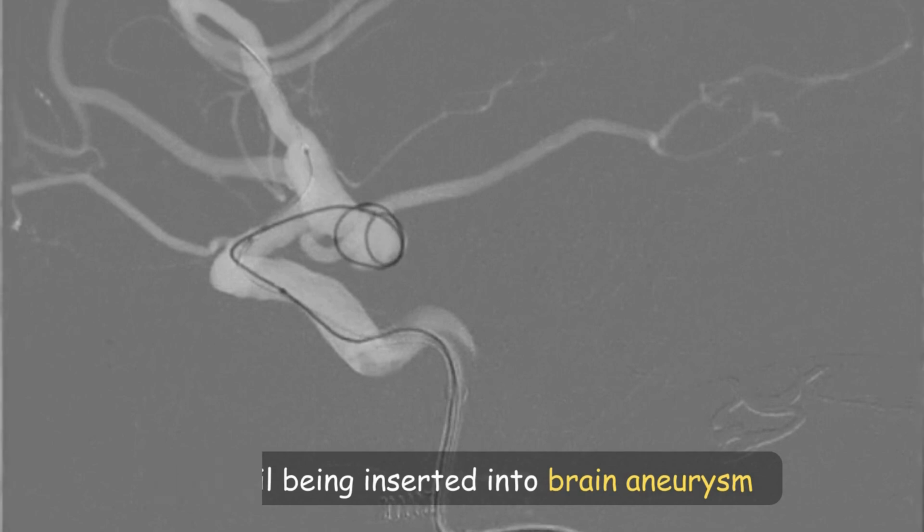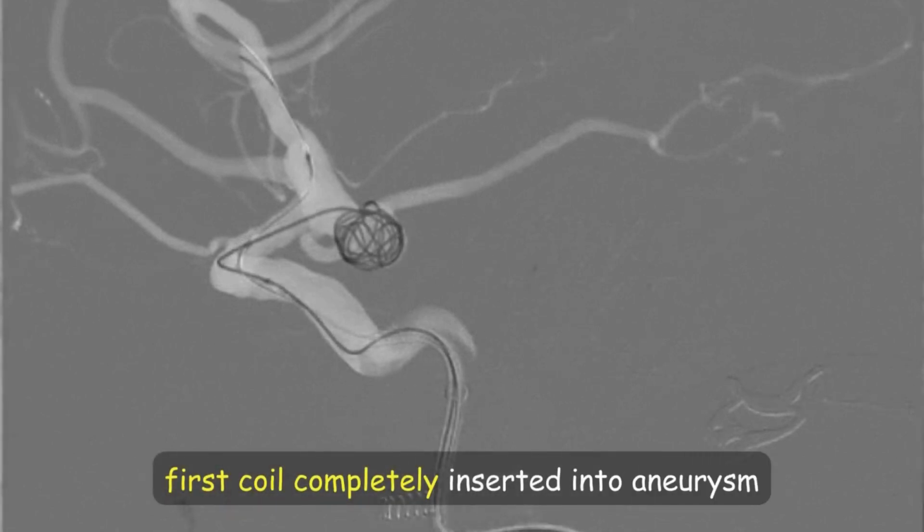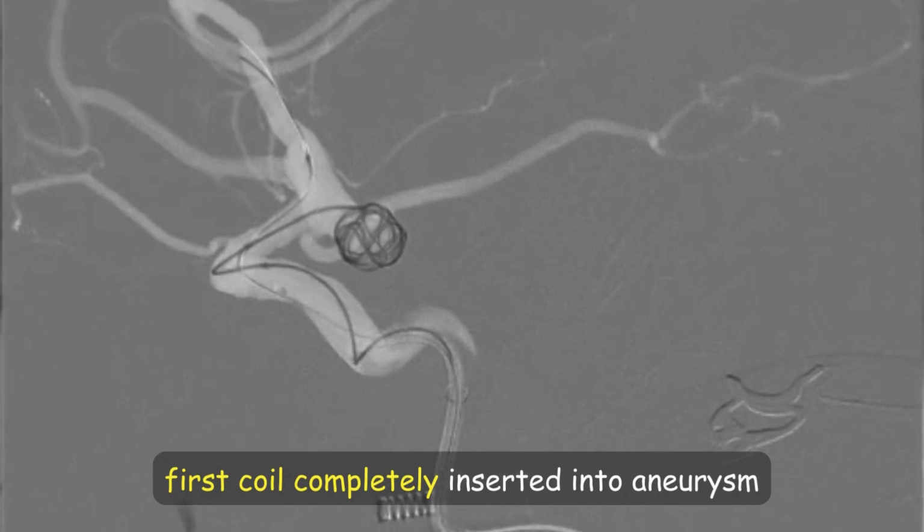So under X-ray guidance, you see the first coil being inserted into the aneurysm. The entire coil is carefully and slowly inserted into the aneurysm.